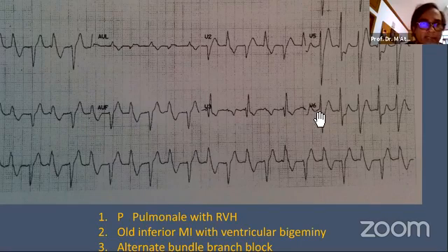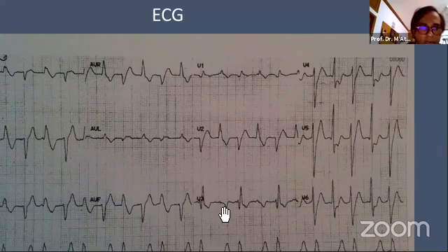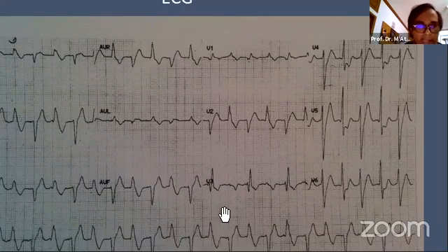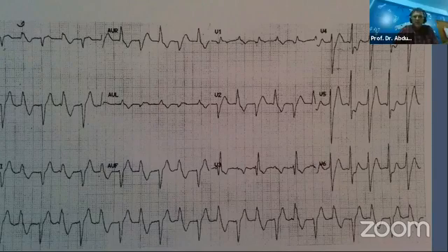তো মেসেজ হচ্ছে যে আমাদের কিন্তু এই যে সাইনাস বিট থেকে আমরা একদম V1 পর্যন্ত যদি একটা শার্প লাইন টানি, দ্যাট হেল্পস টু ডিটেক্ট যে কোন বিটটা আসলে সাইনাস এবং কোন বিটটা হচ্ছে কন্ডাক্টেড। সো এই ইসিজিটা যদিও কমপ্লেক্স, কিন্তু আমাদের পার্টিসিপেন্টের কাছে পি ওয়েভ খোঁজার টেকনিক শেখাটাই ছিল মেসেজ। May I make your comment?